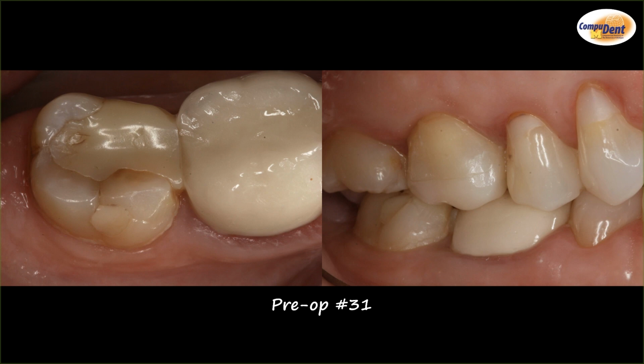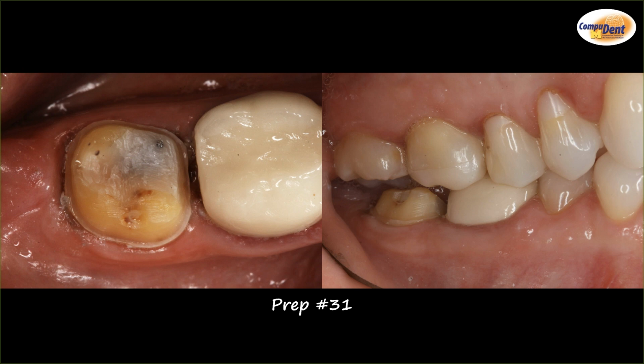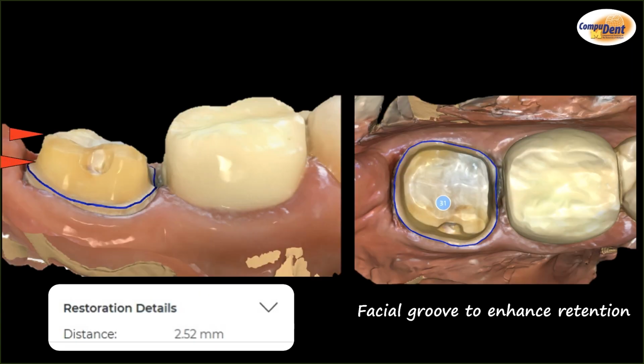So we come back to another example of our short clinical crown situation here, another second molar. We look at the prep, even put a pin in this one, it looks like, in order to hold the core, or trying to build a lingual wall to have some resistance for it, some geometry to it. And you still realize you're on the short side.